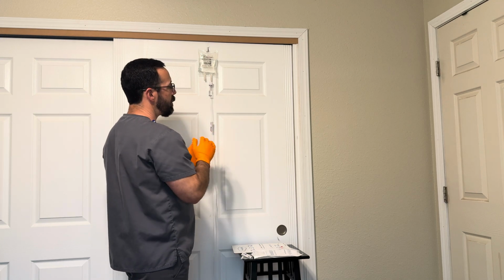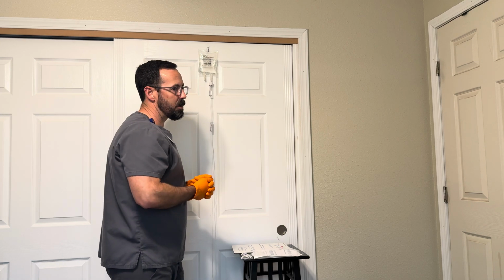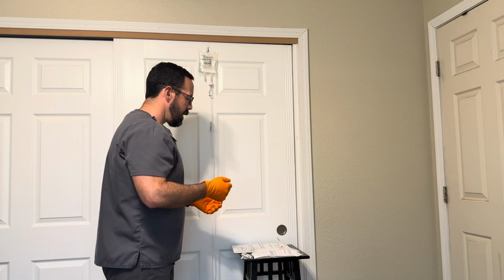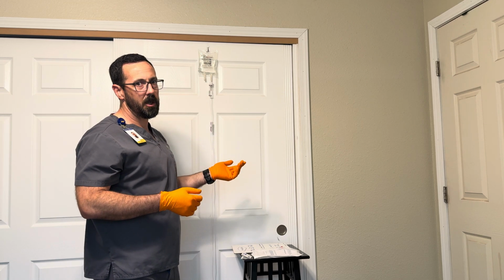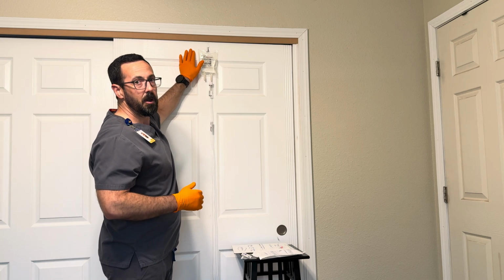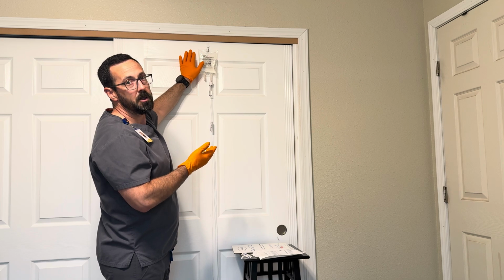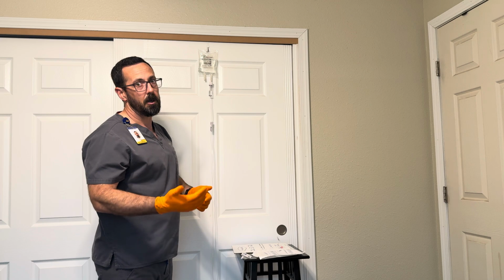Okay, so now I would do the same thing. I would count for a full minute, confirm it's at 38, and then now I need to connect the amoxicillin medication. So we're at 38 drops per minute now. From the adjustment, we counted for a full 60 seconds to confirm it is at 38 drops per minute. Now I need to set up, oh, and also when I hang this, I'm ensuring that it's hung at least 30 inches above the patient's IV administration site for an adult.